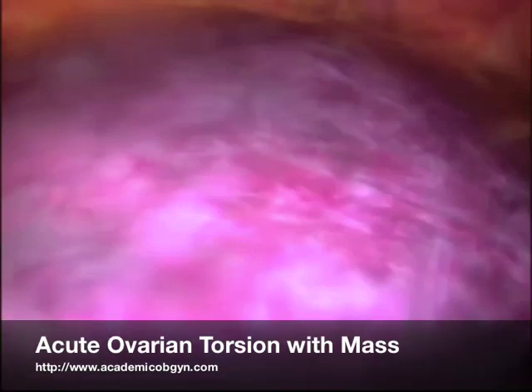So this is a video regarding a patient who came into our emergency department with bad right lower quadrant pain. She had a very large mass on an ultrasound and a history of having had an ovarian cyst about a year previous, which was just being watched. But her pain was severe enough and she had a mass, so we decided to take her to laparoscopy.